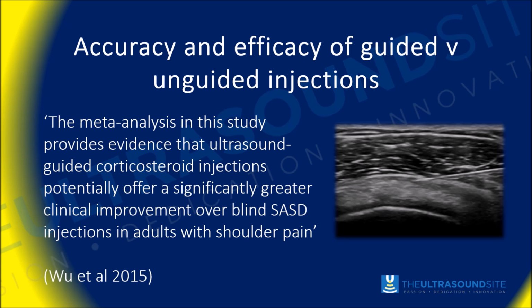A meta-analysis with Wu et al. suggested that there was some improvement, but again, it's whether or not these improvements justify the additional cost, additional potential waiting times. Obviously, there is a much smaller cohort of clinicians that are able to perform ultrasound guided injections currently.